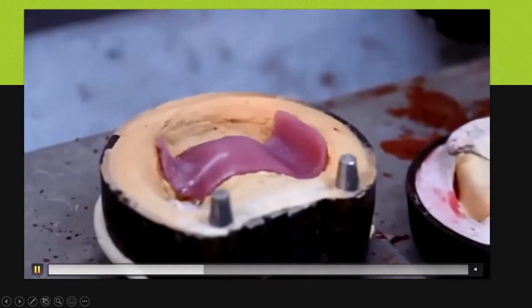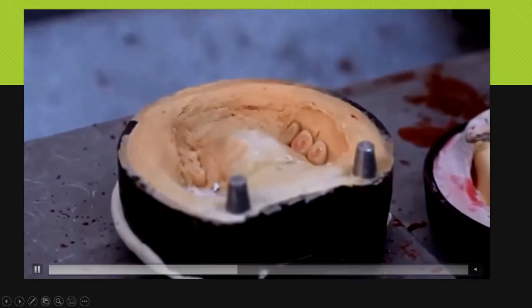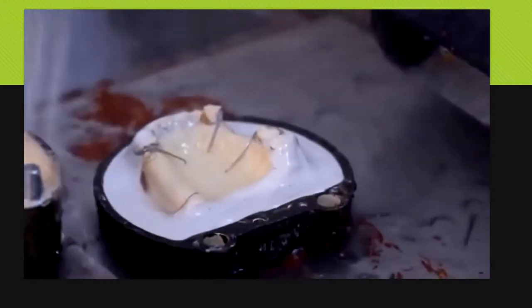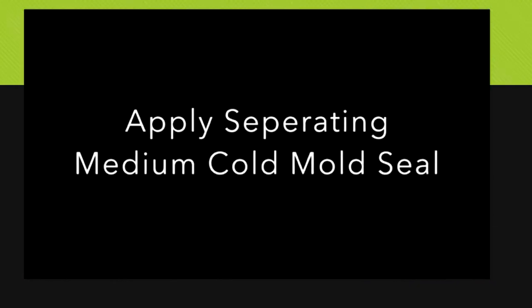The teeth that were placed in the wax pattern now come into the opposite side of the upper chamber, while the lower chamber has the clasps and the cast. Pour clear hot water to eliminate any residues of base plate wax that are left behind. Use clean hot water — not the same wax water from the boiling pot. This helps in elimination of all the wax from the casts.